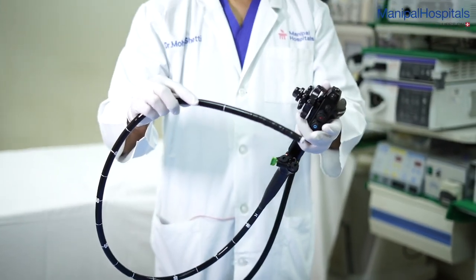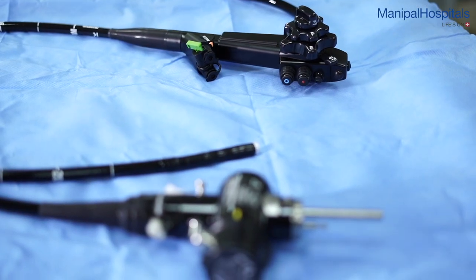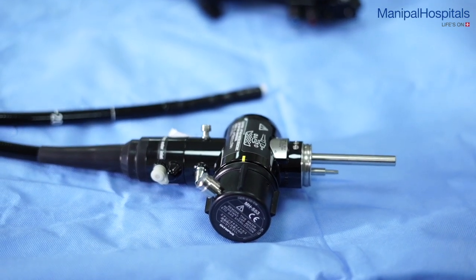On the tip of the device is a special equipment for suturing called the overstitch device, and we control the functions from up here. This device causes restrictions of the stomach by reducing its volume by about 70% by putting sutures at strategic points. The stomach volume is reduced, so much so that the patient eats less and the gastric emptying is slowed down. Gradually, the patient loses anywhere between 15 to 20% of his body weight in a period of 6 months to 12 months, which is roughly about 20 to 25 kilos of his body. This procedure has gained a lot of traction because it is minimally invasive and there are no scars or cuts.